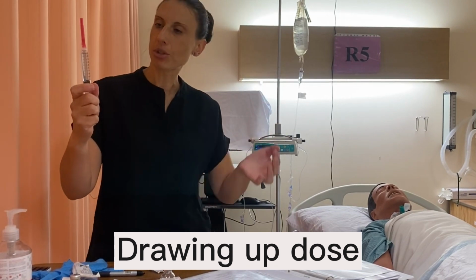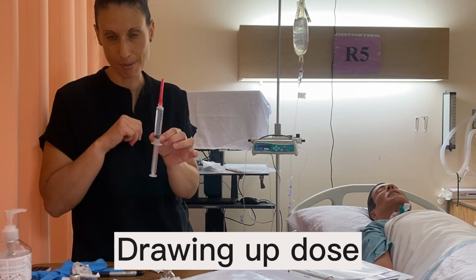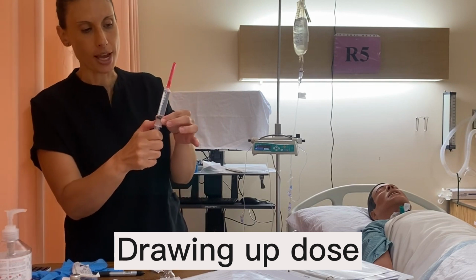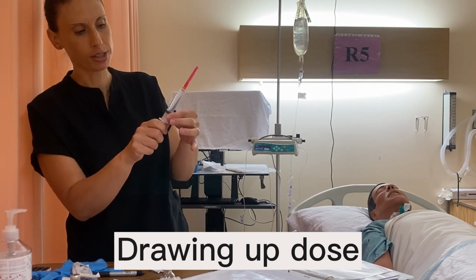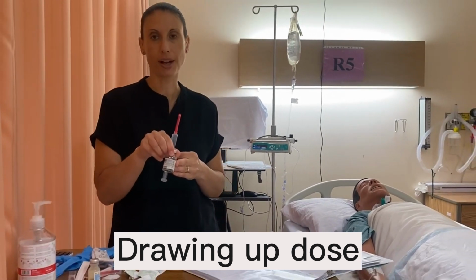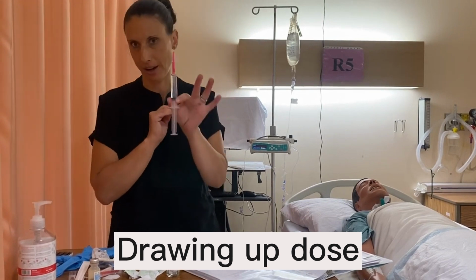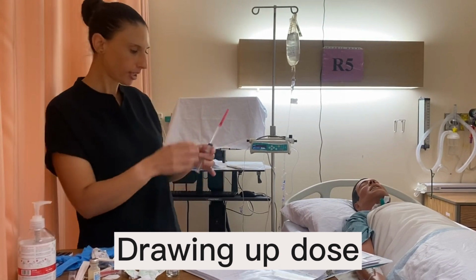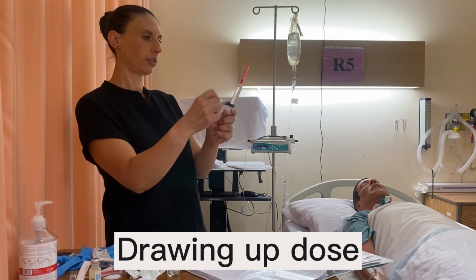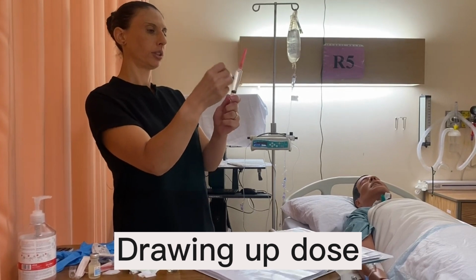So sometimes what you're gonna find is you're not gonna get the full amount that you require in the lab because it's not pretending to puff up, okay? So that's okay. So if I'm just shy of 10 mls, that's all right. Just verbalize, I should get 10 mls from this vial, but because it's a lab scenario, I'm gonna pretend I have 10 mls, okay? Again, we would just wanna make sure we get all of those bubbles out, okay? Because we don't wanna inject that into our patient, okay?